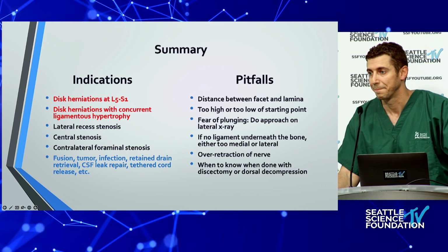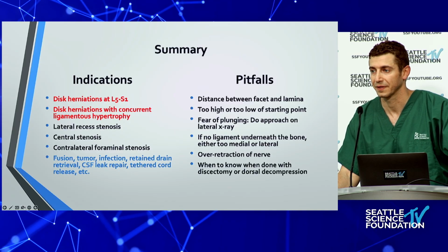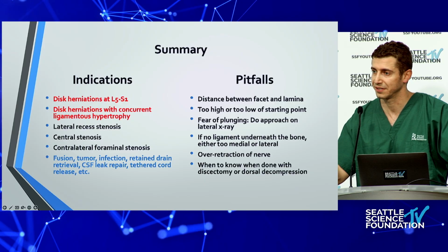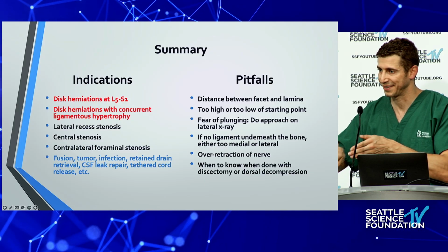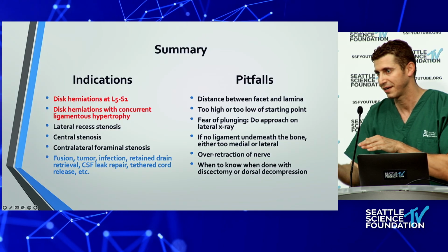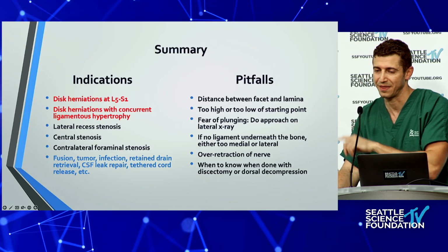If you're telling someone who's new to it, what's another pitfall potentially? No, that's great. I'll definitely add that. But I think the reason why that happens is because the scope is angled. You think you're going straight down, but usually the view that you have is with the endoscope pointing medially. So you think, oh, that's straight down, and then it just kind of pushes you that way. So I think that's one thing.